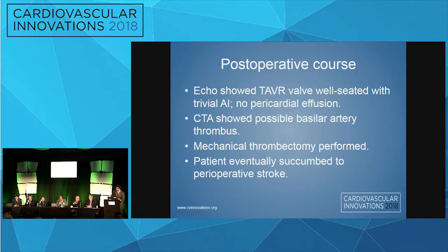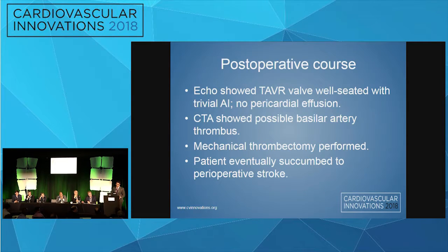What could have happened from a subclavian approach too, though, right? Or a carotid approach. It looked to me like you had a pretty good position. You were doing great. And then the guy had an acute event, which could have happened with anything.